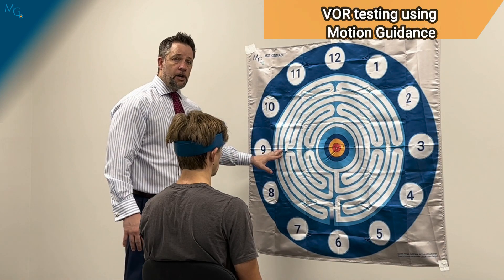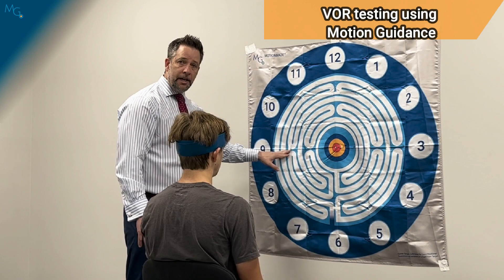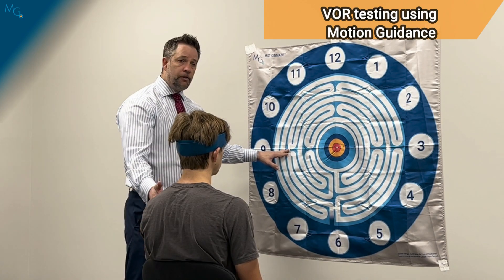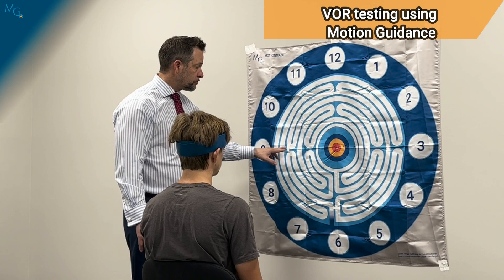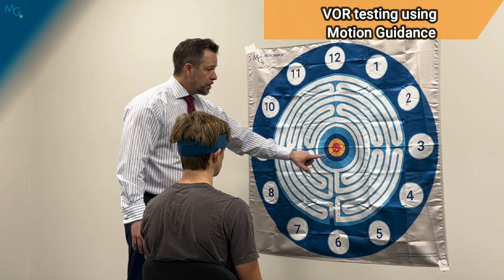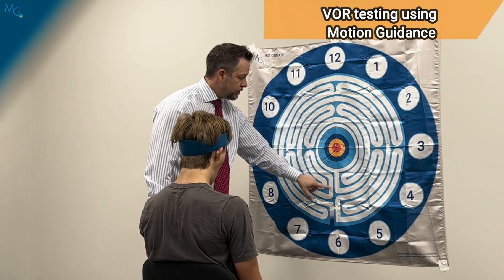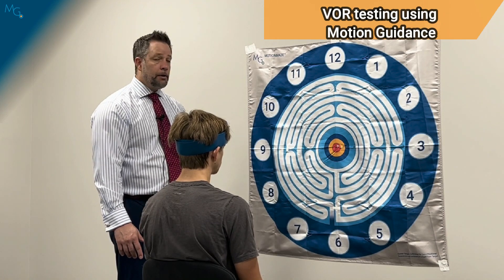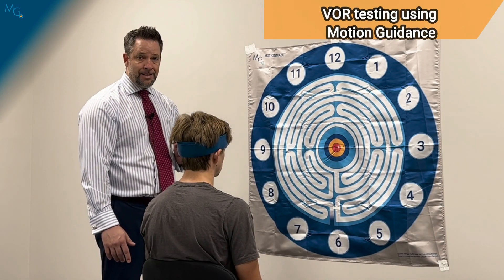For this test on the motion guidance device, you only need to move 20 degrees off of center, and from three feet away that puts us at one foot or 12 inches from the center of the target. I've put small pieces of tape on the horizontal axis as well as the vertical axis to mark where that one foot or 20-degree arc is.